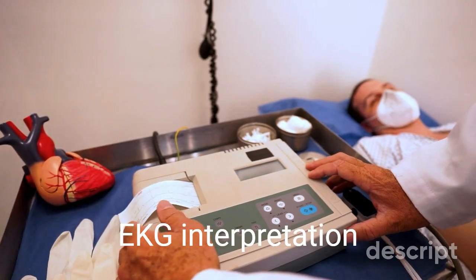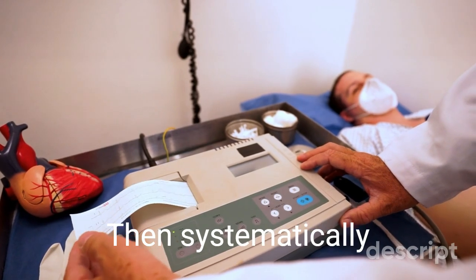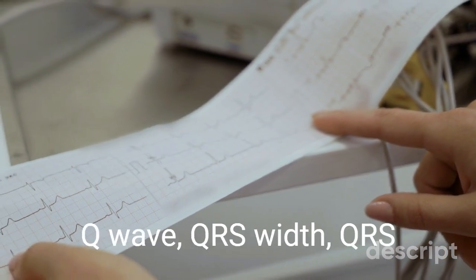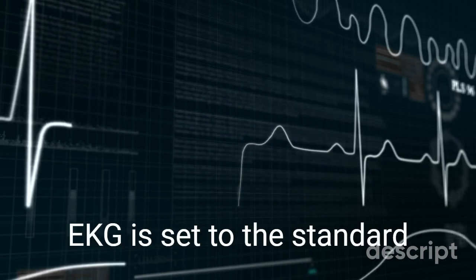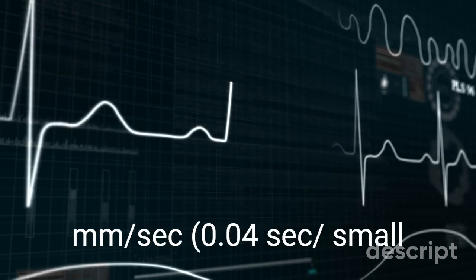EKG interpretation. An EKG reading starts with looking at the whole picture first, then systematically reading as follows: standardization, rate, rhythm, axis, P-wave, PR interval, QRS complex, QT interval, ST segment, T-wave, U-wave. Standardization: see if the EKG is set to the standard gain, 1 mV equals 10 mm, 25 mm per second.